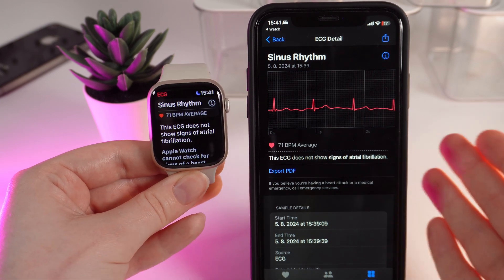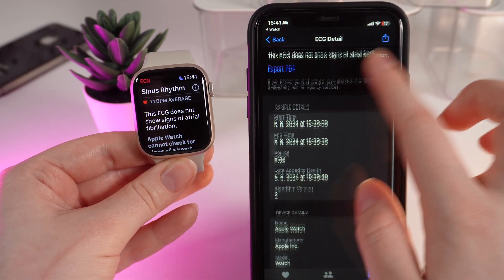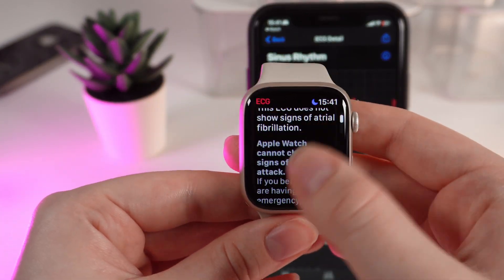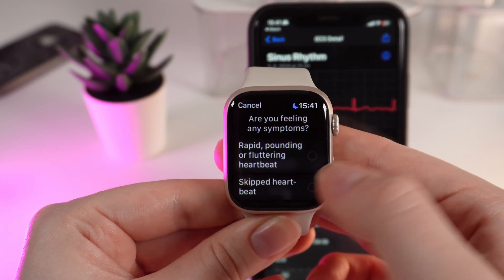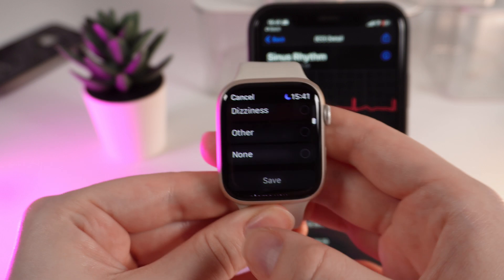After the recording is done, you'll be able to check the recording on your phone and see some additional info. Also on your watch, you can add symptoms if you are not feeling well — for example, rapid pounding or fluttering heartbeat, and many others.